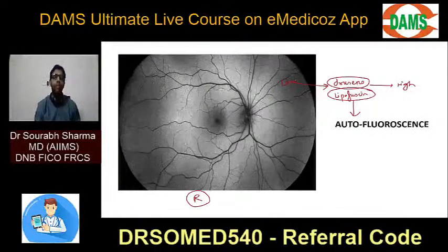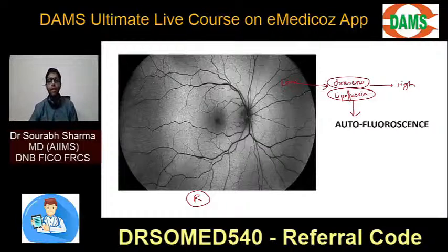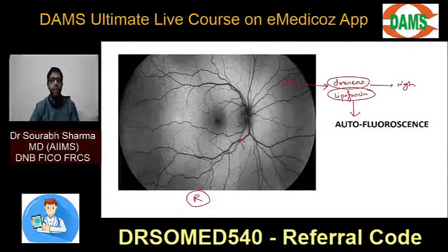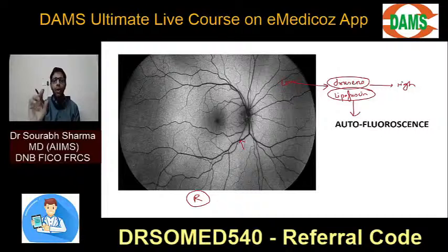This is autofluorescence. So how will you differentiate a fluorescent angiography from autofluorescence? Look at the vessels. If there is dye in the vessels, it is angiography. If the vessels are dark, it is autofluorescence. Some examples quickly I'll tell you for autofluorescence.